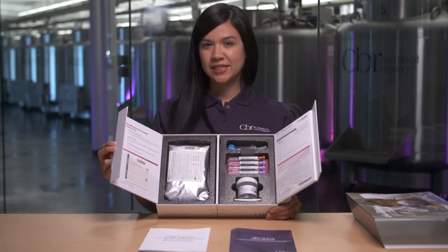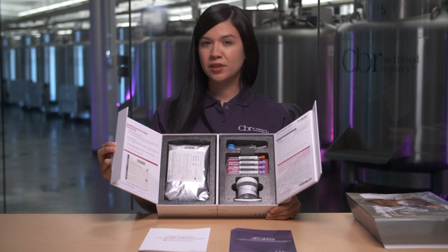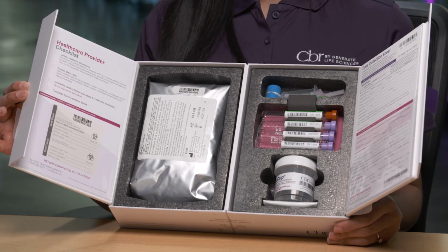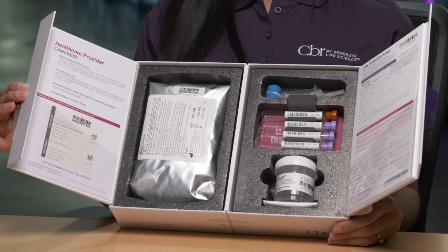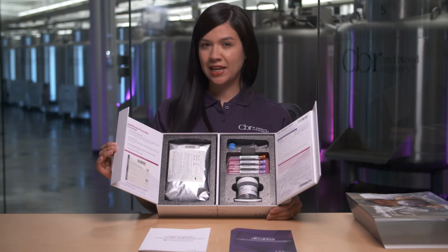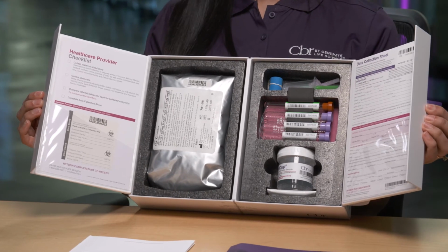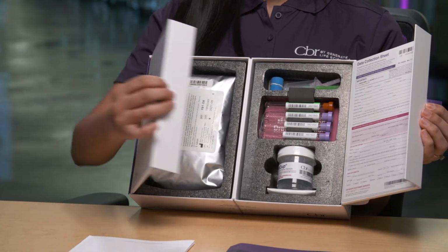Once the doctor performs the collection, they'll hand you or your birthing partner the kit. Make sure your birthing partner is prepared for this step. Look inside the kit and make sure everything is in there properly. Look for the cord blood, the cord tissue if collected, the maternal blood draw tubes, and the data collection sheet. If everything is in there, then the kit can be sealed up for shipping.